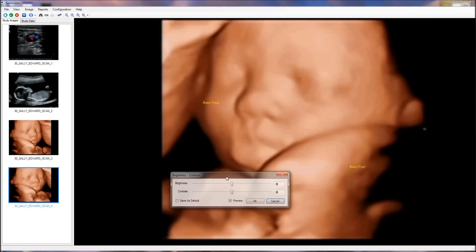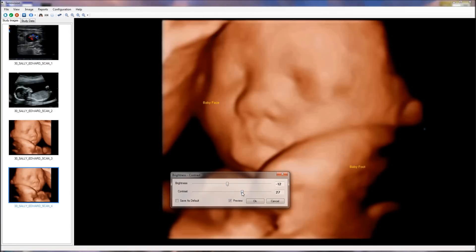You can also enhance the image by setting its brightness, contrast, color levels, and other image enhancement options.